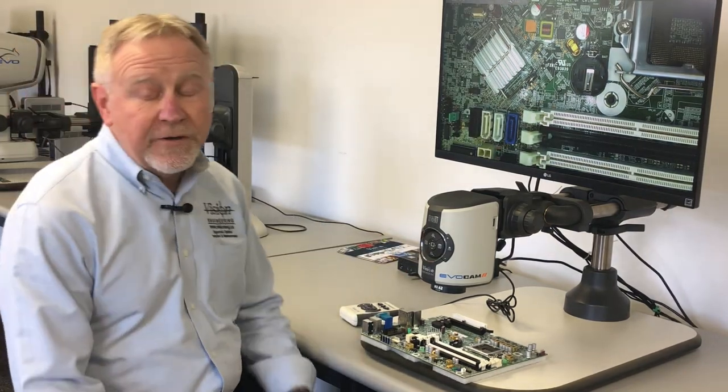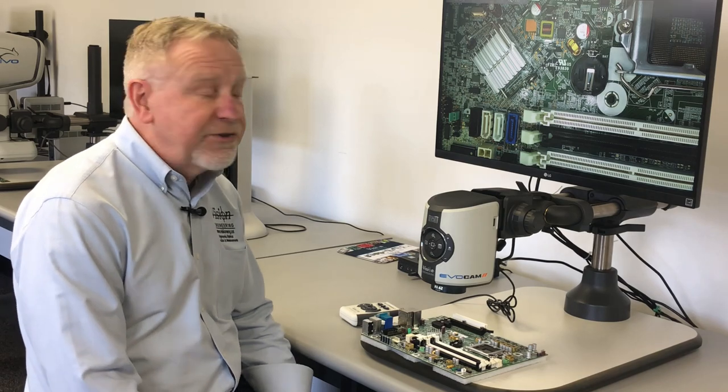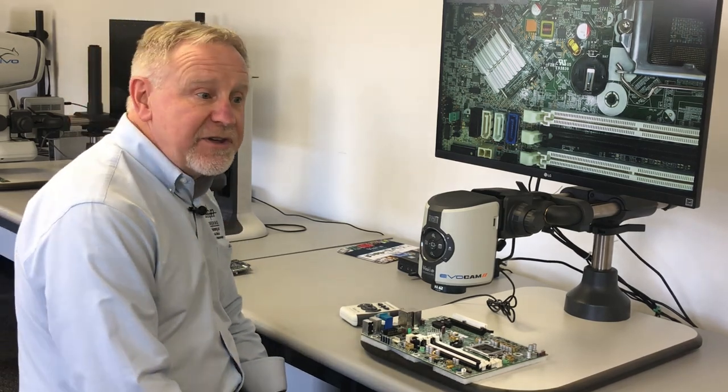If we alter the firmware in the camera, we can go through a digital zoom, which will give you even higher magnification capability.